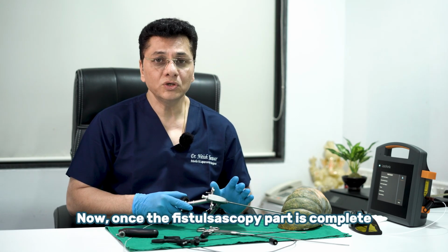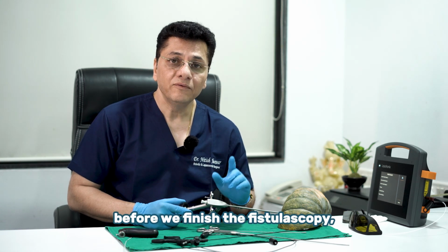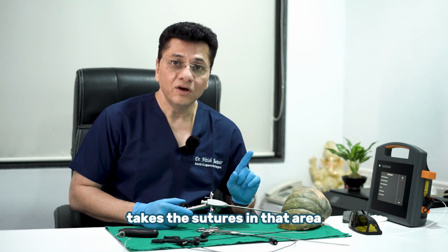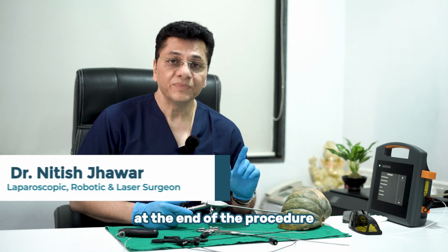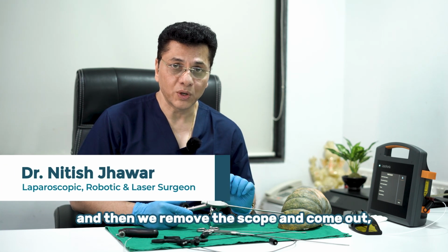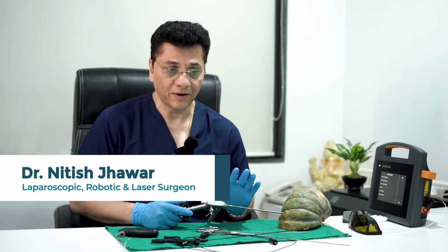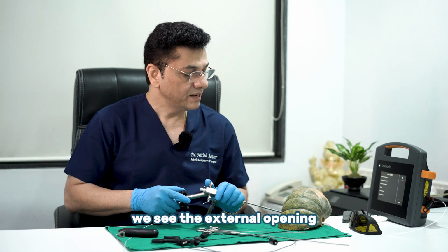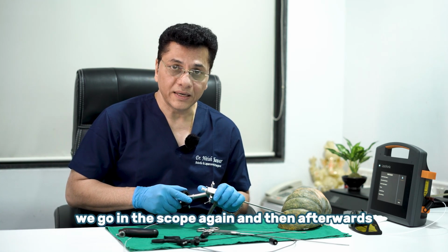Now, once the fistulascopy part is complete, before we finish the fistulascopy, we locate the internal opening and place stay sutures in that area, which will guide us for closure at the end of the procedure. And then we remove the scope and come out, and we do the operative part of the VAAFT technique now. Suppose we have come out of the tract, we see the external opening. If it is not wide, we make it a little wider. We go in with the scope again.